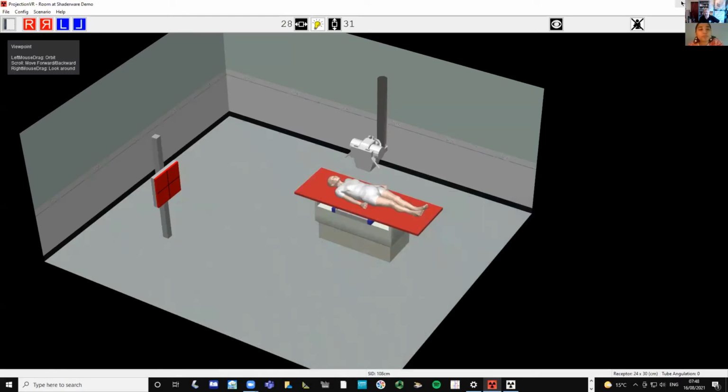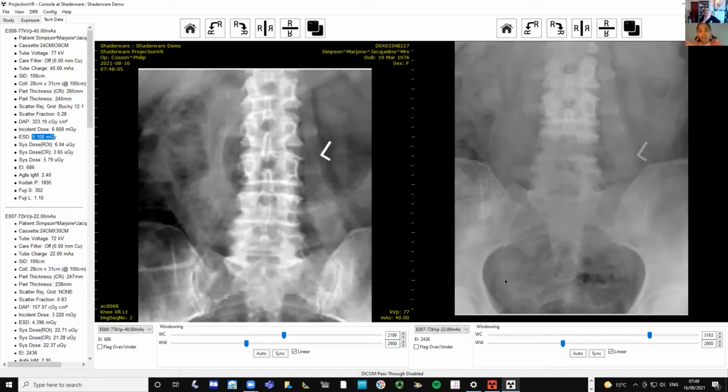All right. So this is very interesting. I just need to ask you a very important question. Actually, I'm taking some photos and sending them to my group mates, my counterparts, the deans who will also be requesting this from the administration, because I know this is very comprehensive software for radiographers, student radiographers, and also for us instructors.